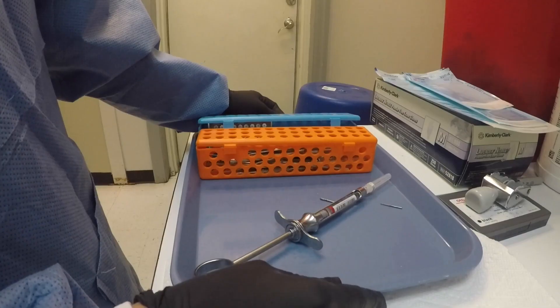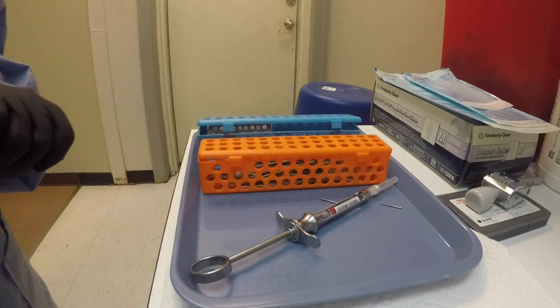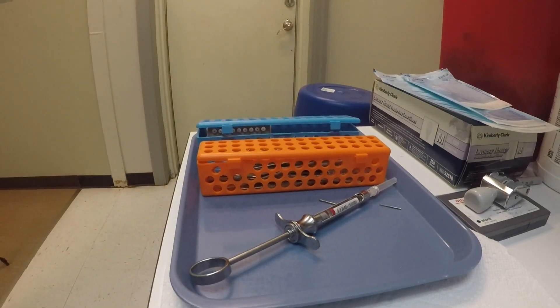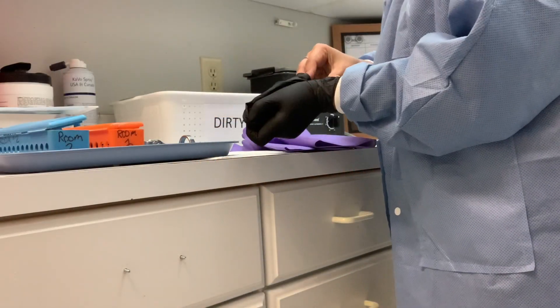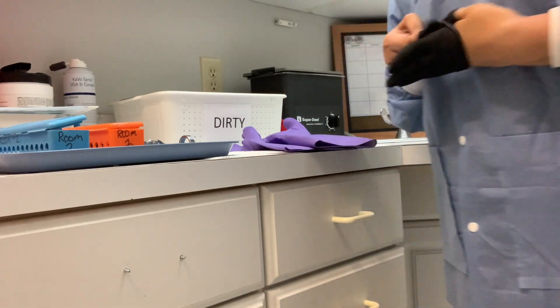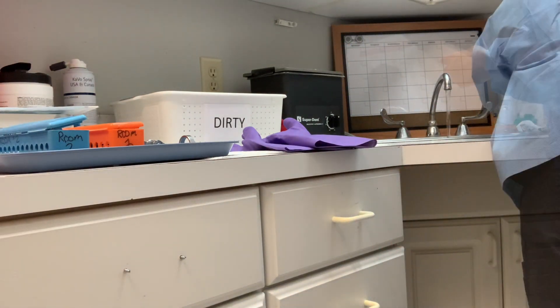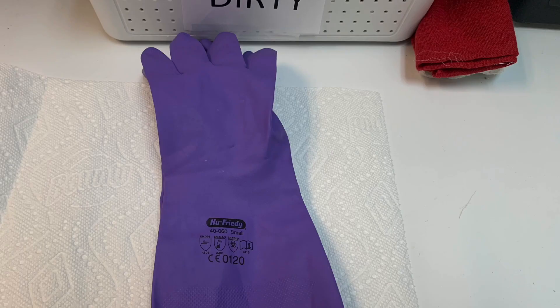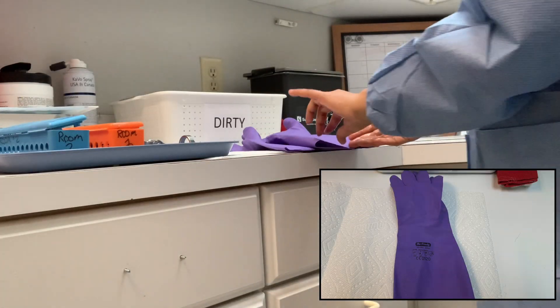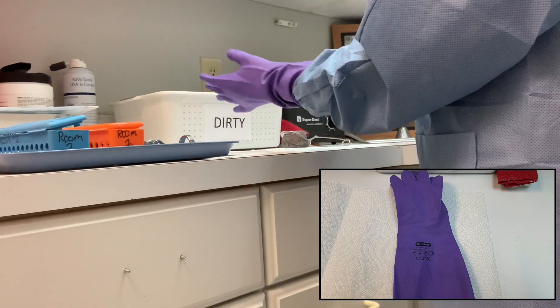Let's start. We begin by bringing our dirty instruments from the operatory in closed containers. All sharp instruments should be brought in closed containers — in my case I use steady cages because they're easy to work with. Then I remove my gloves and wash my hands, then wear utility gloves. These should be puncture and chemical resistant and autoclavable.